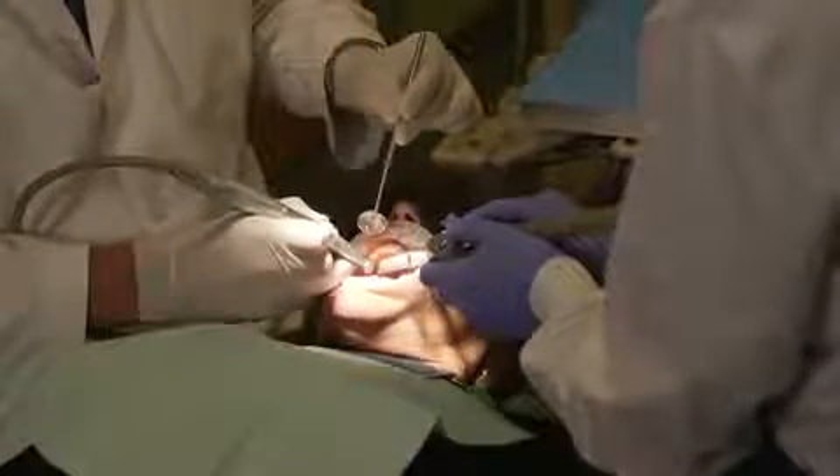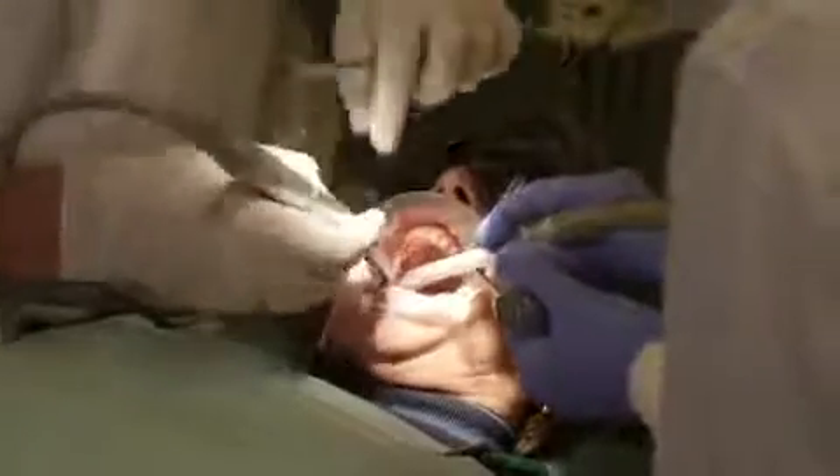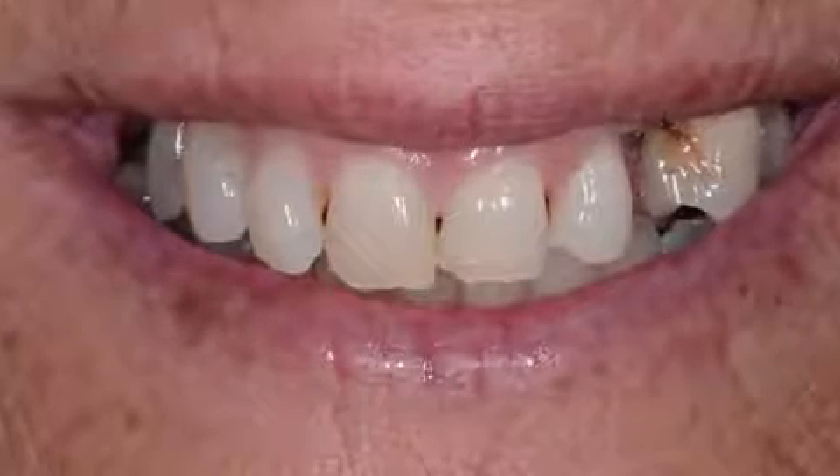So this case presentation is a little bit unique. The patient demanded some high-end aesthetics to replace her front teeth, and her challenge was that in the posterior she had missing teeth and she did not have enough bone for implants.